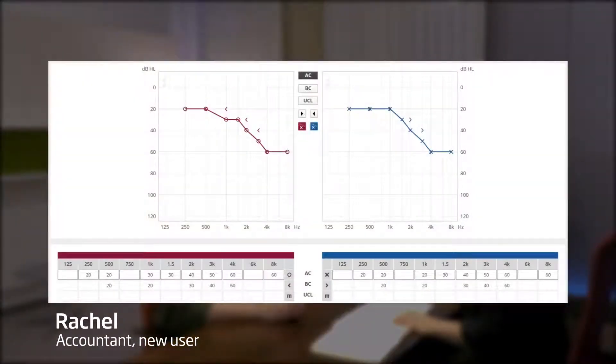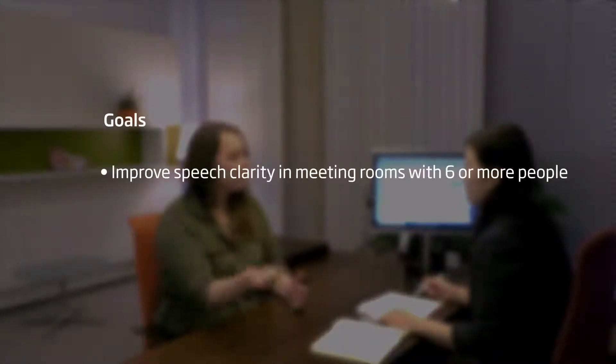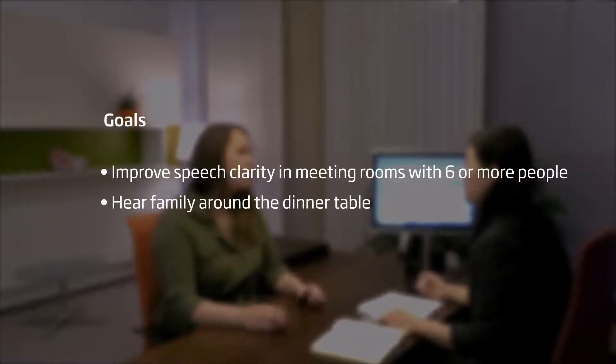This is Rachel. She has never been fitted with hearing aids previously. She has a mild to moderate sensory neural hearing loss. She leads an active lifestyle and is looking for hearing aids that can help her understand speech in more challenging situations at work and in social situations. The most difficulty she has is when there are multiple people in the same room talking at once. Rachel would like to hear with improved clarity in meeting rooms with six or more people. Rachel would like to hear family around the dinner table without needing to ask them to repeat themselves.